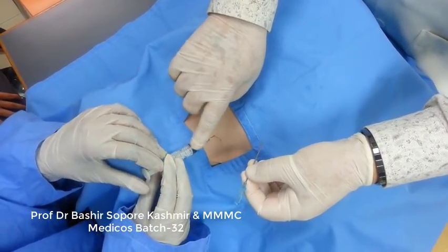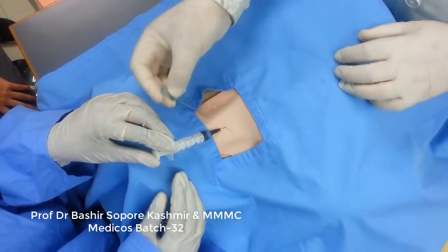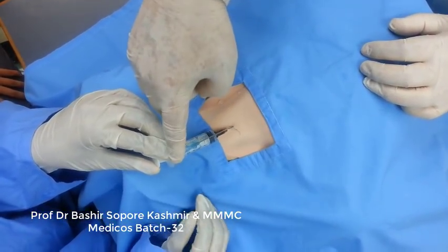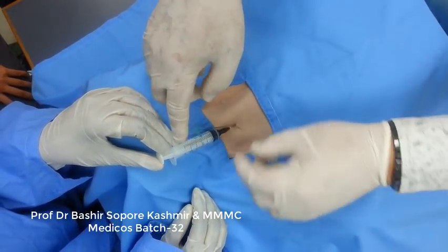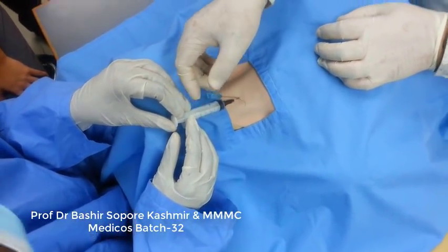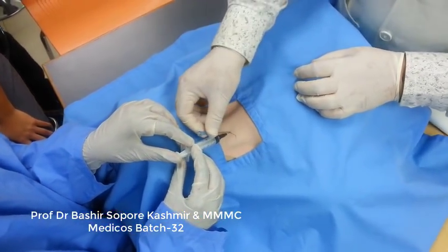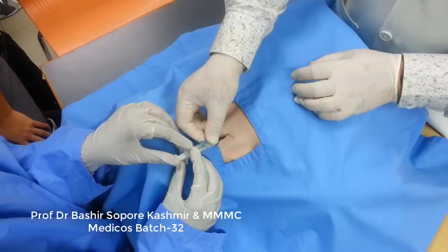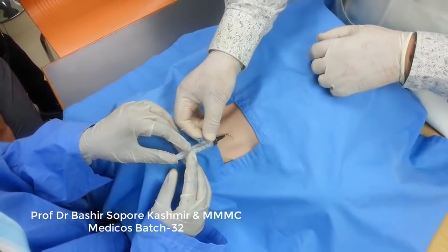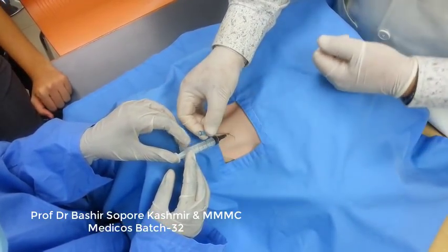You don't remove anything. Now there are two methods. One is that you take this needle and go along the finder needle like this, down. I know that when it touches the needle, it will go into the internal jugular vein. So this needle can be inserted parallel to the finder needle. Then it's easy, isn't it? You will not have to search this way and that way, and there will be less injury.